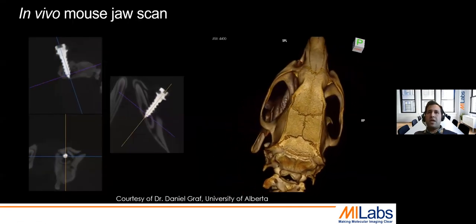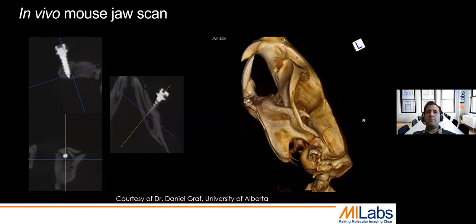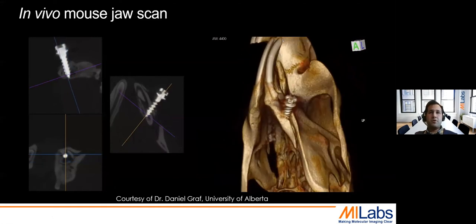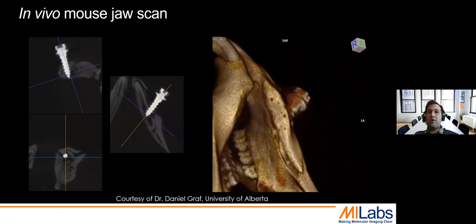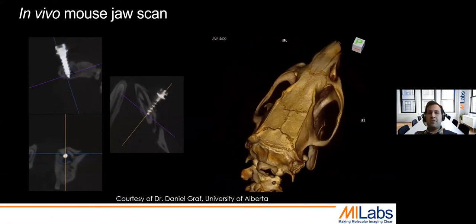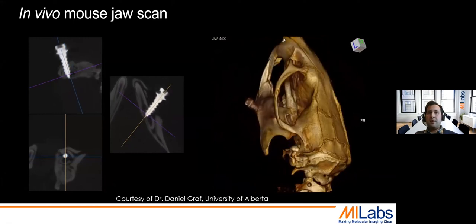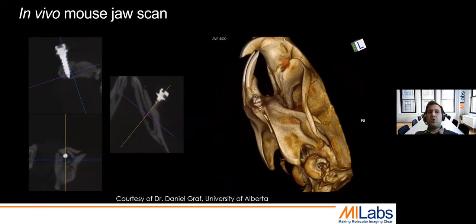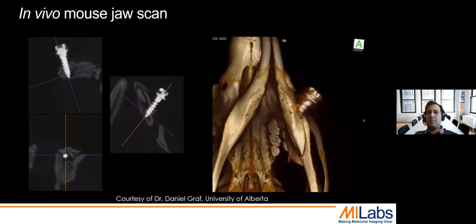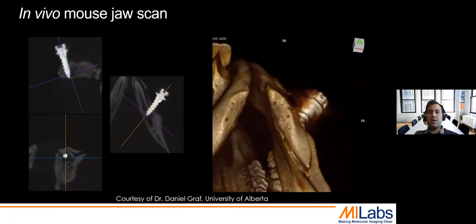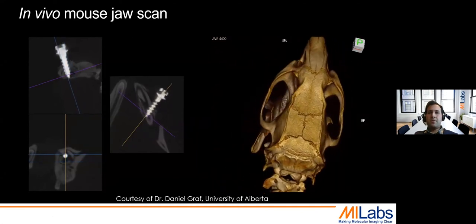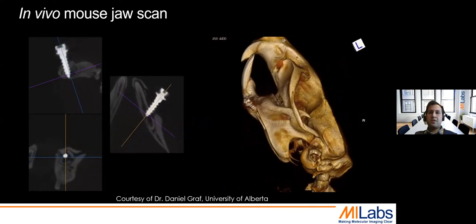With our technology and by using optimal CT acquisition parameters, we were able to acquire very nice images and see the bone around the implant very well. This scan was done on the mouse jaw. We can see the implant itself, the bone surrounding the implant, and we can do all sorts of rendering.